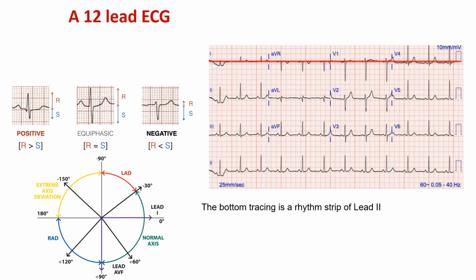Let's discuss vectors. What is a vector? A vector is basically a force. And this force has a magnitude and it has a direction. It's usually depicted by an arrow, and that arrow signifies the strength and the direction of that force.